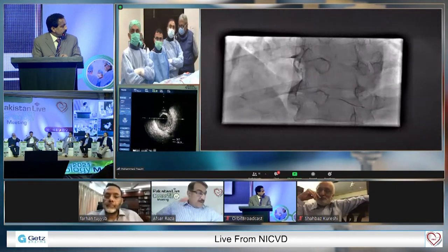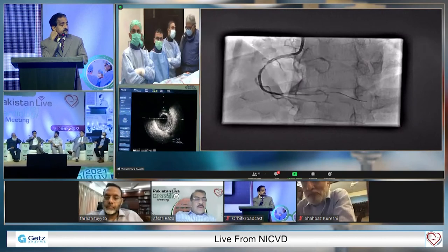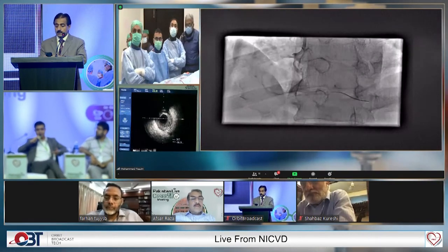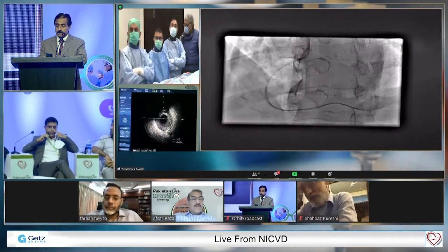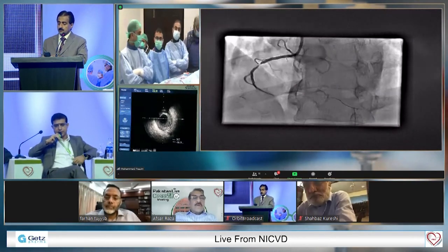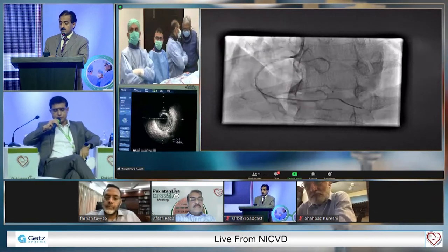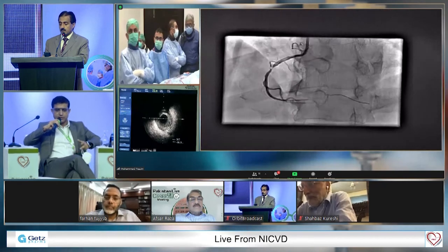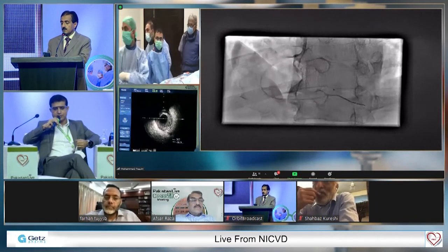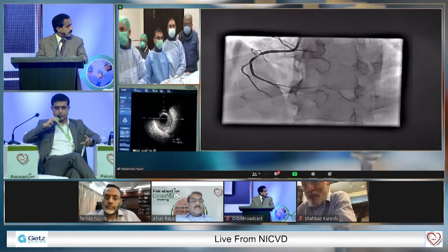I want to discuss that. In our lab, we don't use aspiration catheters frequently, only in selective cases when we have a large thrombus burden. An interesting study was recently published in the SKY trial, showing the difference in infarct size. Theoretically, the main thing we had in mind was that with the use of an aspiration catheter we may reduce distal embolization, which would decrease infarct size and improve long-term and short-term outcomes. But this recent study was the first that compared the CMR infarct size between two groups, with and without aspiration catheter.